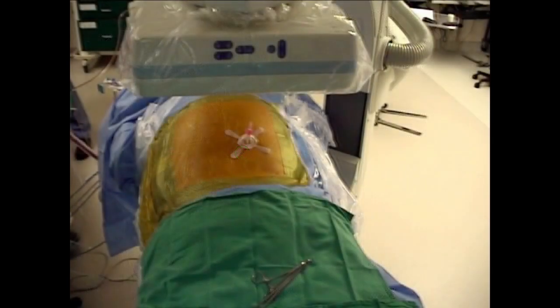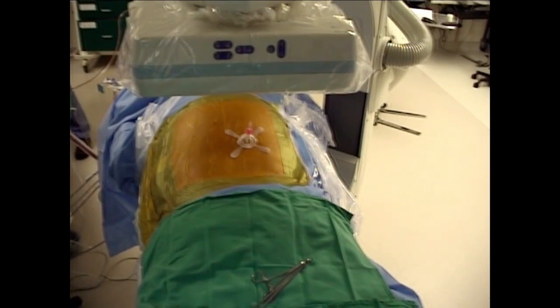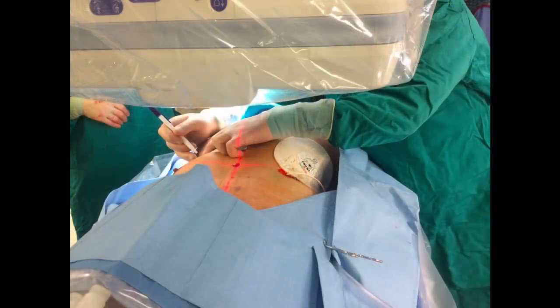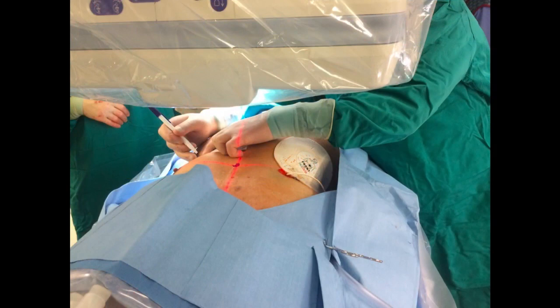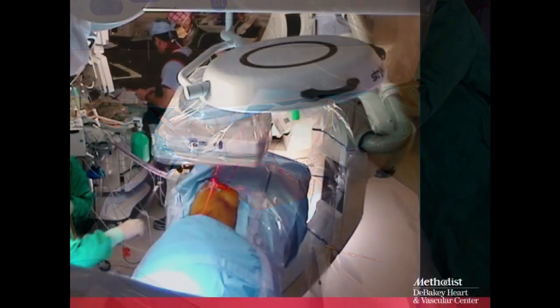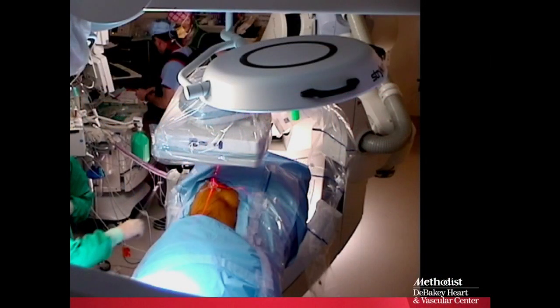We use this thing called the C-STAR, which helps stabilize the needle as it's being advanced, because it's very difficult to bend once it's inside the patient. We use laser guidance — once you're in the bullseye view, it shows you where to go ahead and insert. This is actually accessing a ventricular pseudoaneurysm directly, and we've also used it in other situations like lung biopsies.